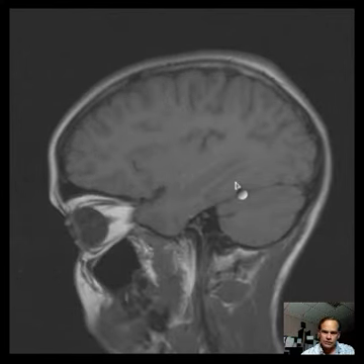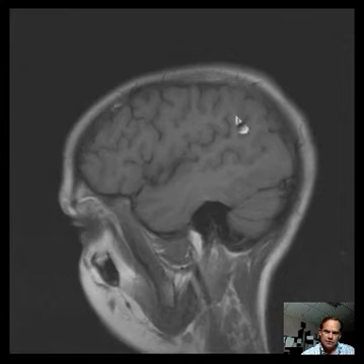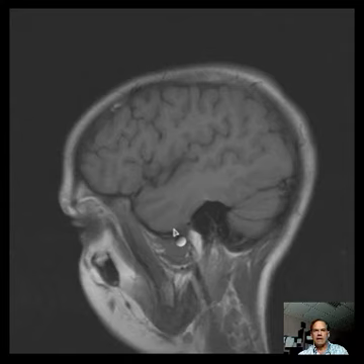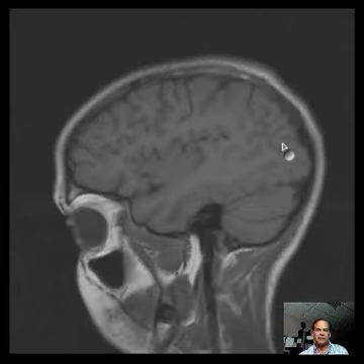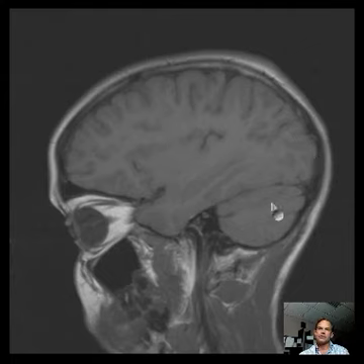Here you can see the temporal lobe, which makes this fissure the sylvian fissure. If you follow the temporal lobe far enough back, you find yourself in the occipital lobe right here. Also notice how the temporal-occipital area is separated from the cerebellar hemisphere.